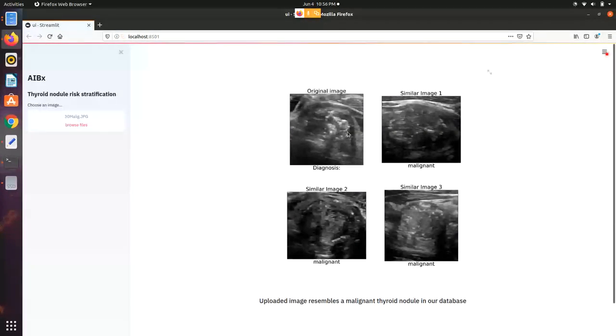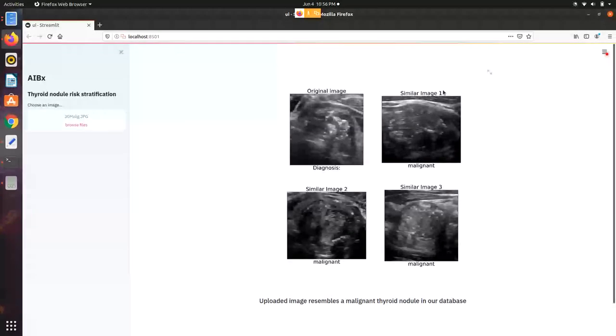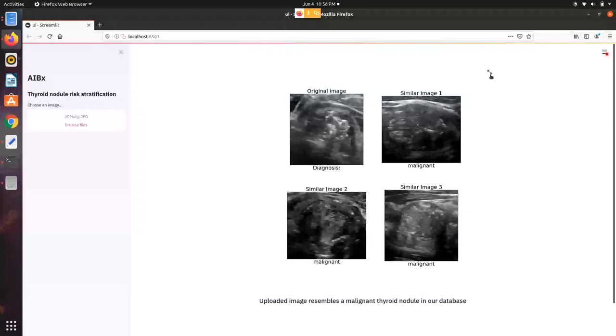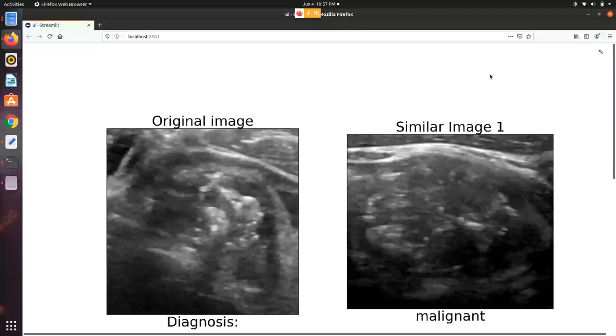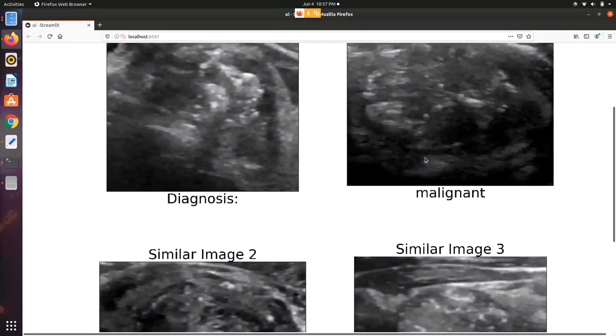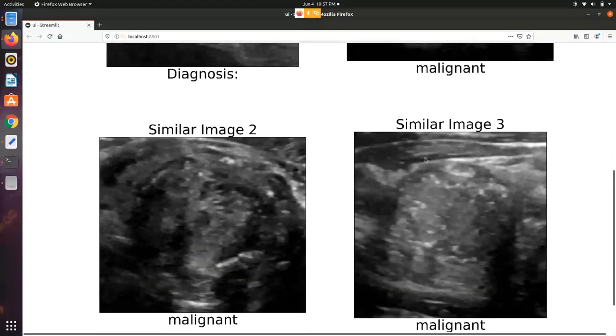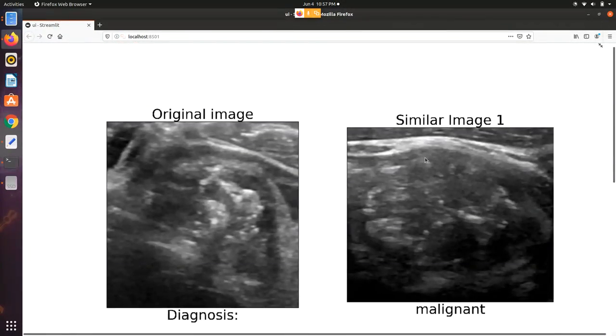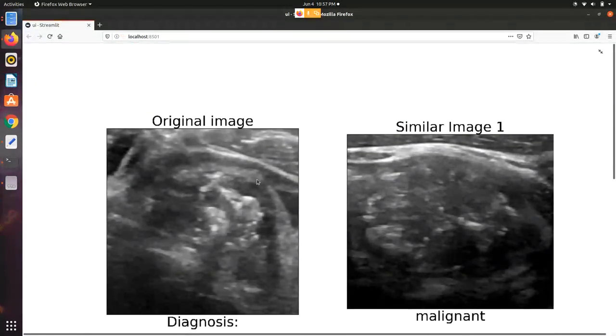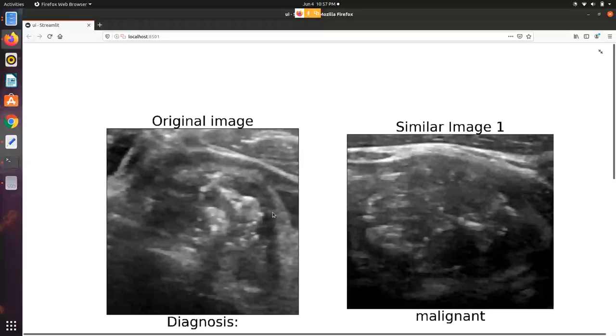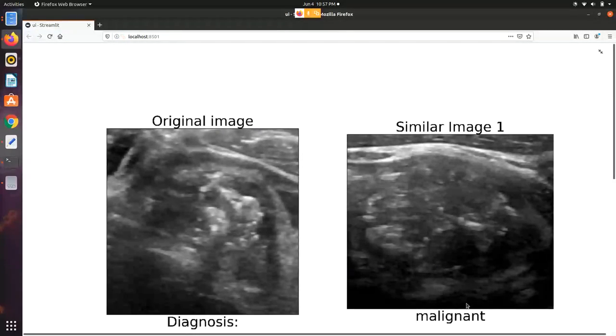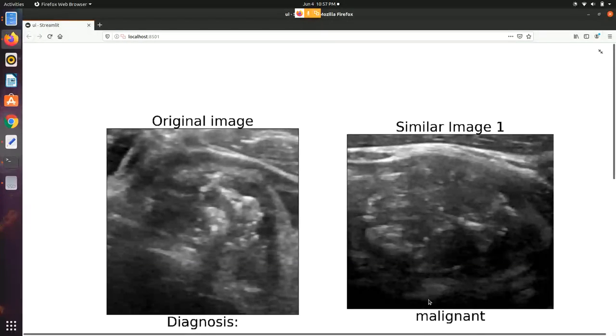This is the original image and this is the similar image along with the diagnosis. Now we can also expand and enlarge it. You can see that the original image had calcification and this looks similar to the original image, and the diagnosis for that was malignant.